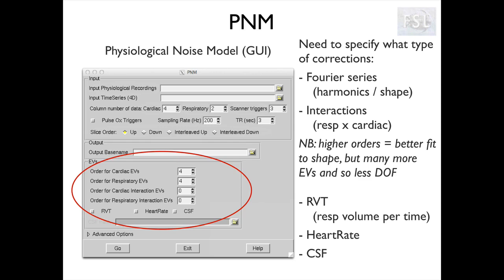We can also set interactions between the respiratory and cardiac cycles - for example, it is plausible to assume that the heart will beat at different rates during the breathing cycle. Additionally, we can select other additional EVs like the respiratory volume per time, which is related to the oxygenation of the blood, the heart rate, and the CSF mean signal. The latter is the only one that is not derived from the recording but from the data itself.